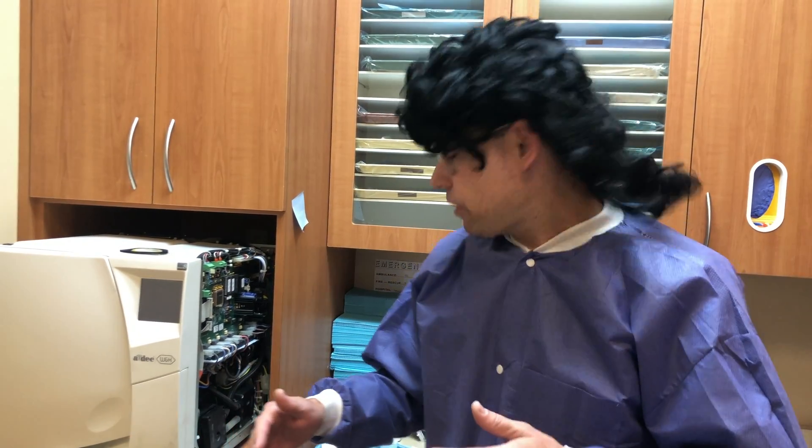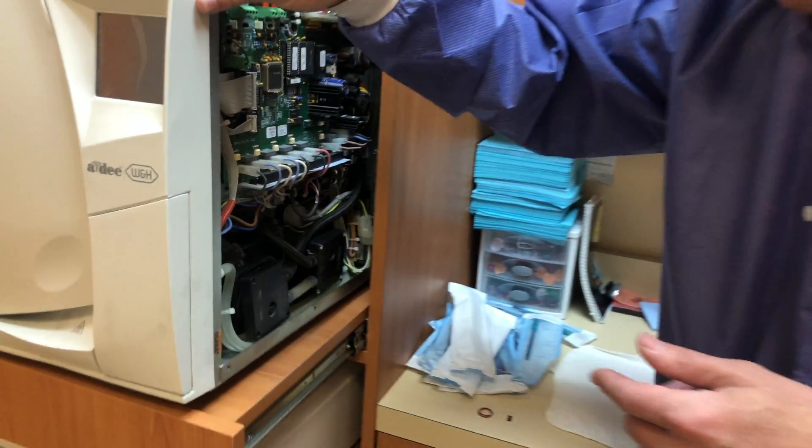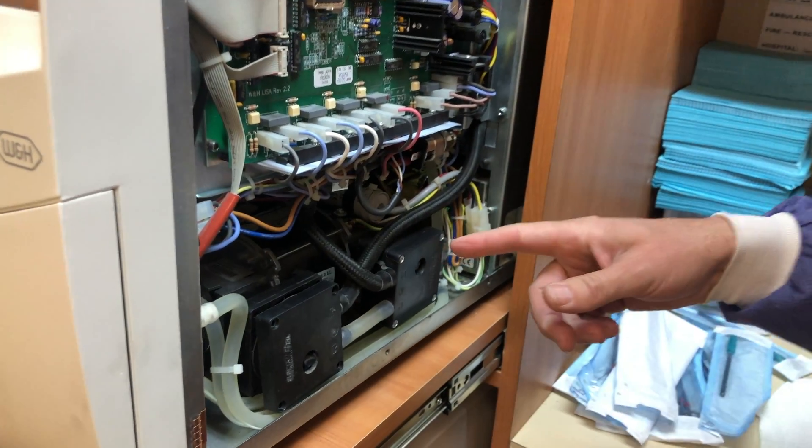So this thing has to create a vacuum to negative 7.2 PSI in 4 minutes. The vacuum pump was going and it was sucking the vacuum, but not fast enough — it threw a fault. So I took apart the unit and here's the vacuum pump.